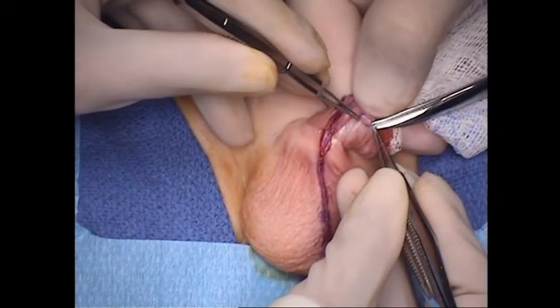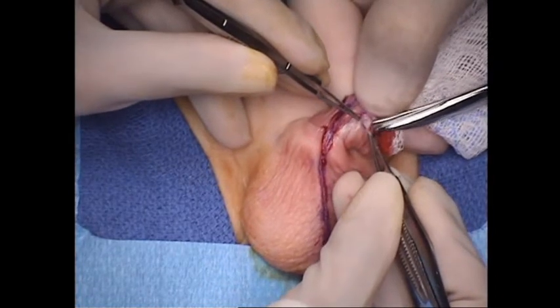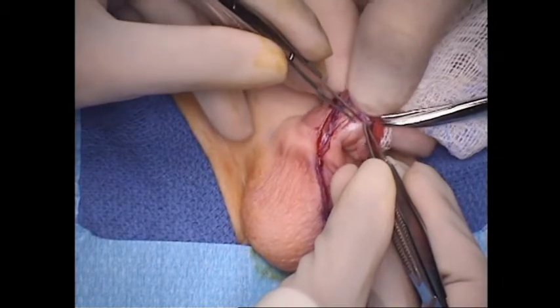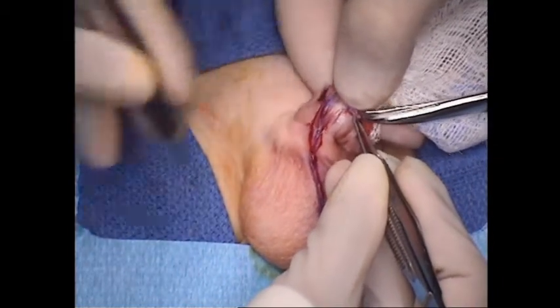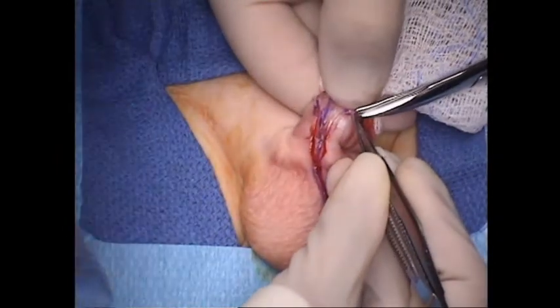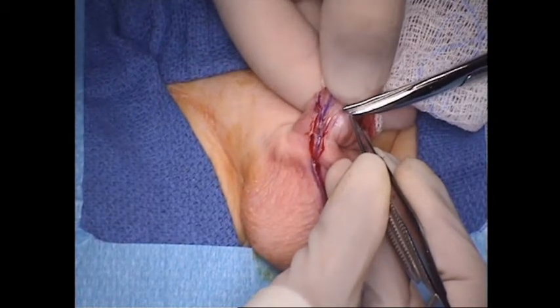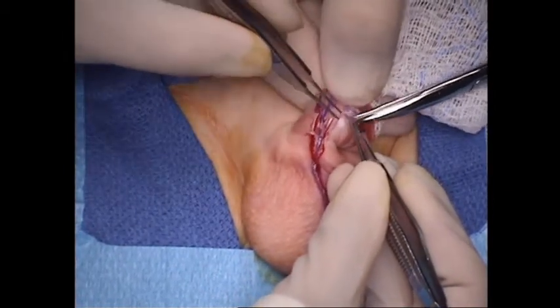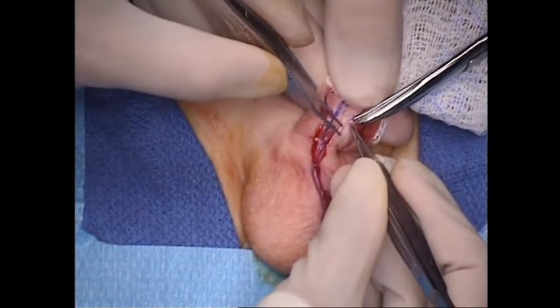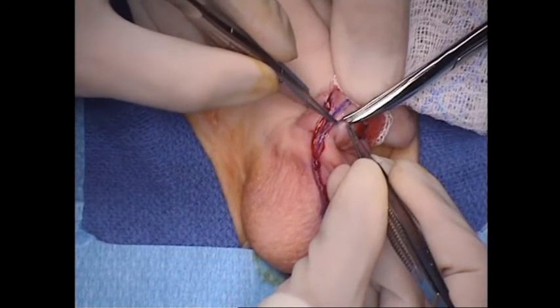So we'll begin degloving now ventrally, and we're going to go right under the skin. Again, she mentioned that the skin can be attached directly to the spongiosum. Can't even hold it there. Minimal or no dartos. And so we're going to dissect right under the skin to stay out of spongiosum tissues. And this is often one of the trickier parts of the surgery, is to get this plane started correctly.